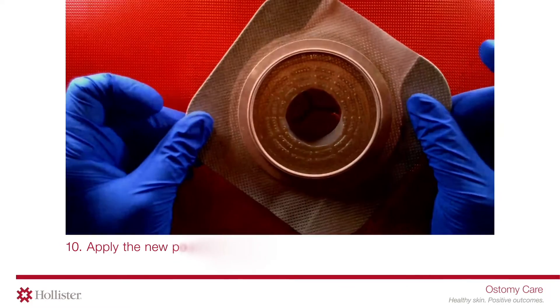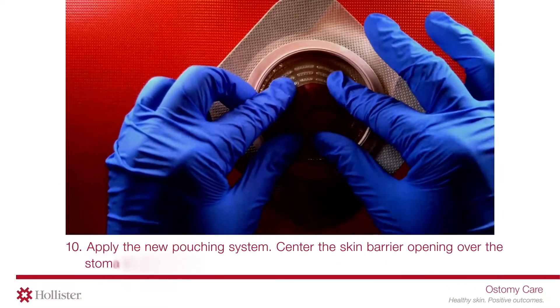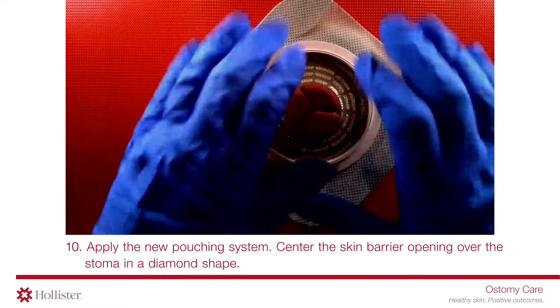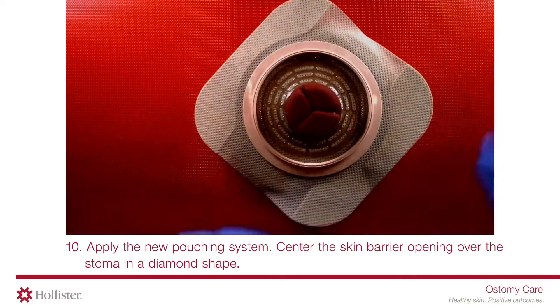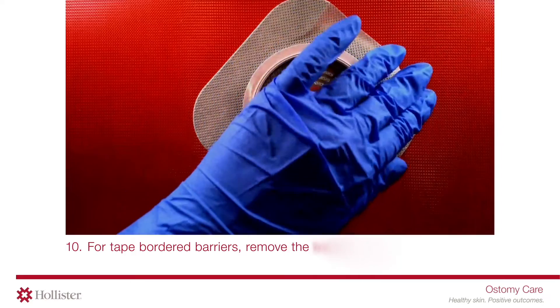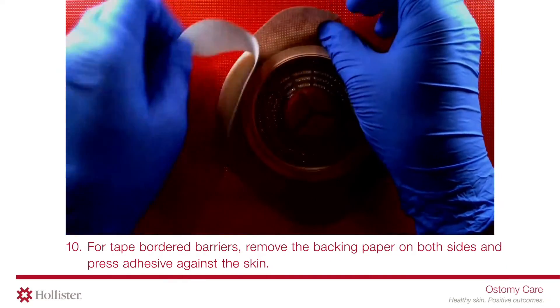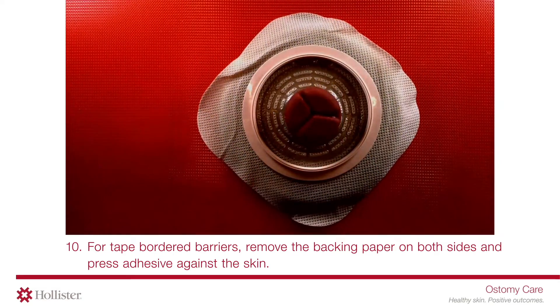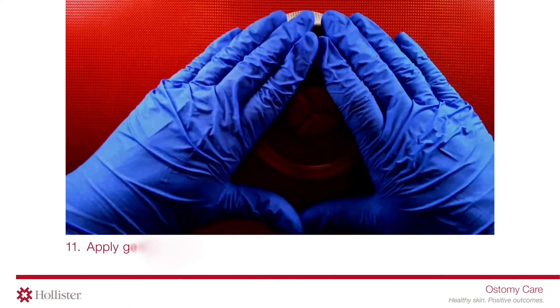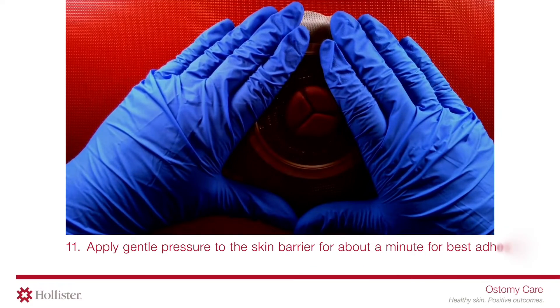Apply the new pouching system. Center the skin barrier opening over the stoma in a diamond shape. For tape border barriers, remove the backing paper on both sides and press adhesive against the skin. Apply gentle pressure to the skin barrier for about a minute for best adhesion.